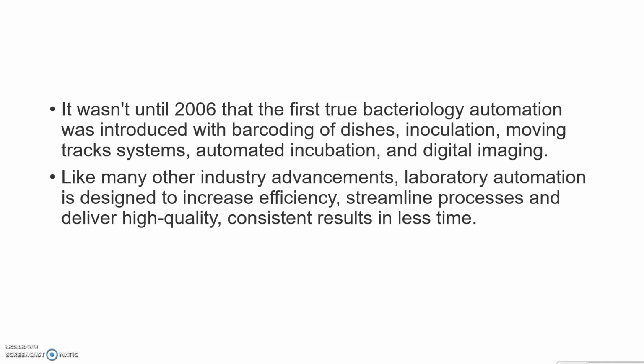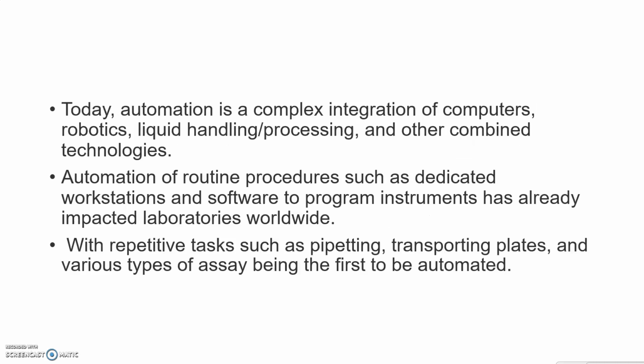Like many other industry advancements, laboratory automation is designed to increase efficiency, streamline processes, and deliver high quality, consistent results with less time. Today, automation is a complex integration of computers, robotics, liquid handling, processing, and other combined technologies.